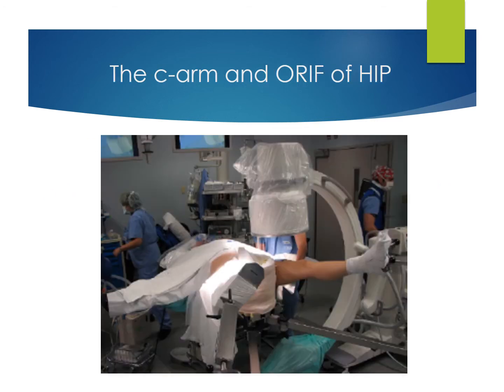Here is an example of ORIF of the hip. Looks like they decided not to place the shower curtain.